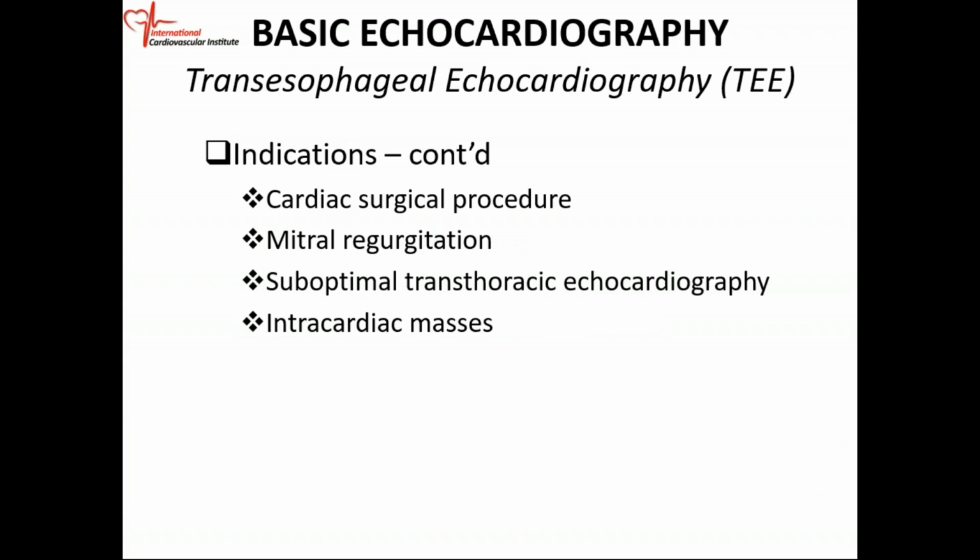Again, cardiac surgical procedures: more and more heart procedures are done under the guidance of transesophageal echo. So in the larger institution, you have a dedicated team that just works in the cardiac suite, and they'll be doing transesophageal echo all day, because you'll have a lot of cardiac procedures.